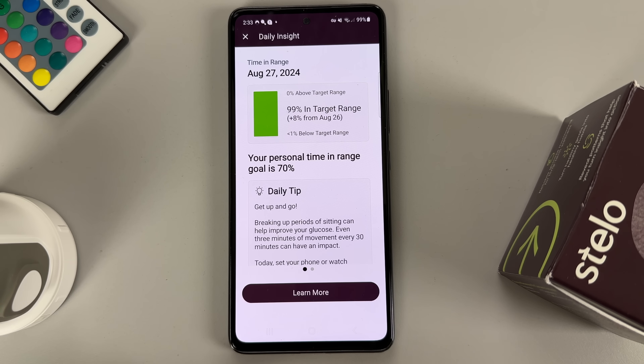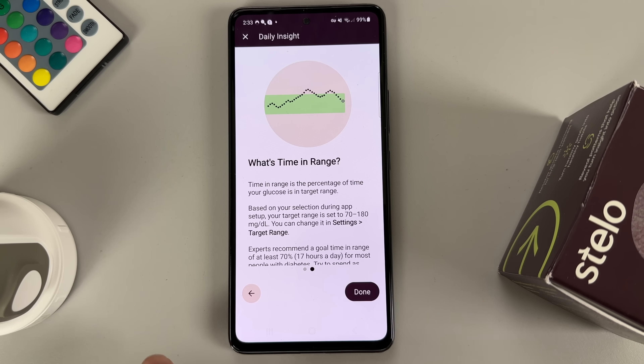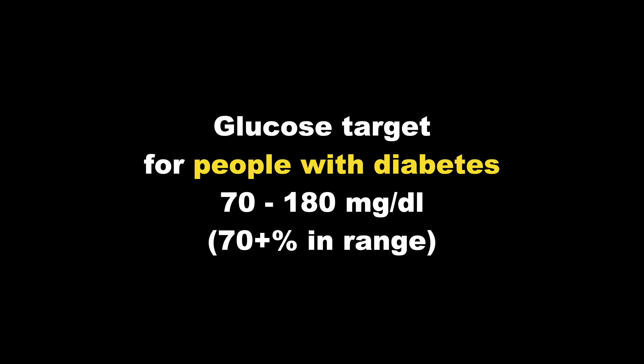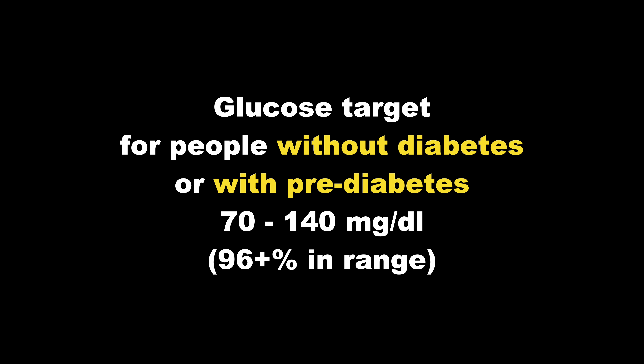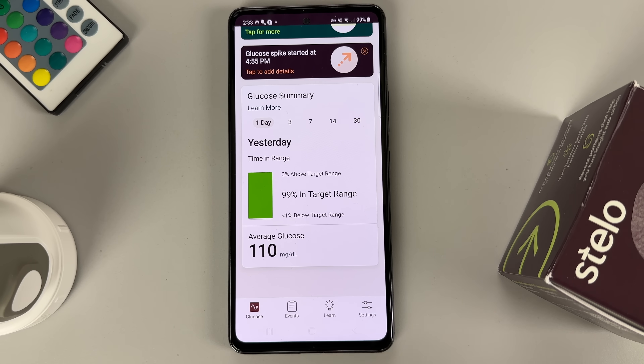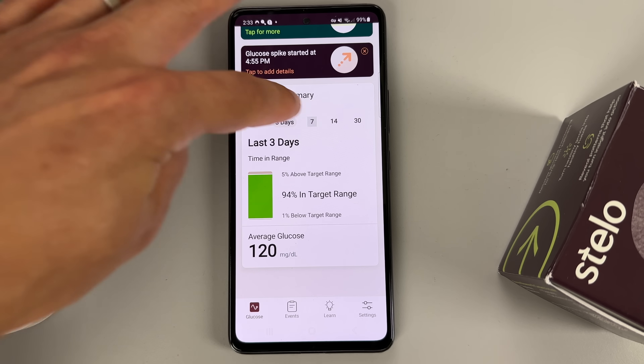Another helpful feature of the Stello app is that you get daily insights about how much time you spent in the ideal glucose range during the last 24 hours. The target for people with diabetes like Jerry and me is between 70 and 180 milligrams per deciliter, with a daily goal of at least 70% in range. The target for people without diabetes or with prediabetes is between 70 and 140 milligrams per deciliter, with a daily goal of at least 96% in range. We also liked that the glucose summary section shows how much time you spent in the target range for the past 3, 7, 14, and 30 days.